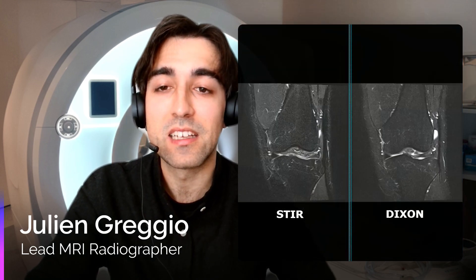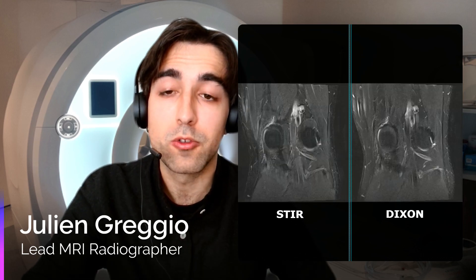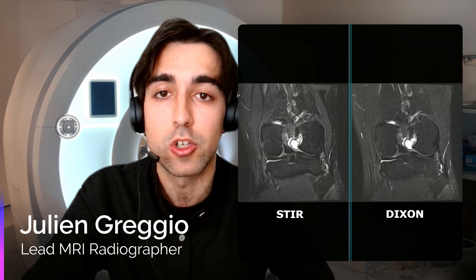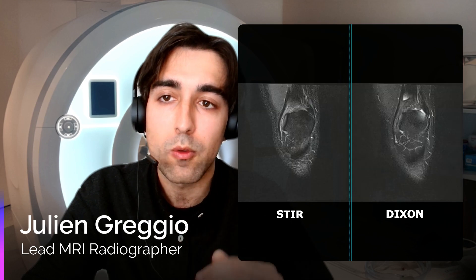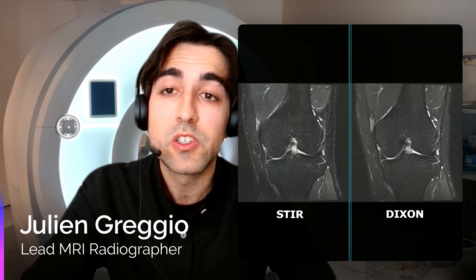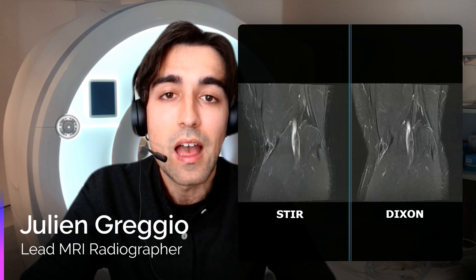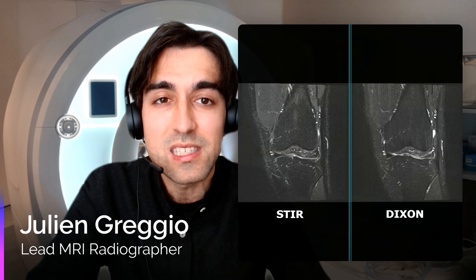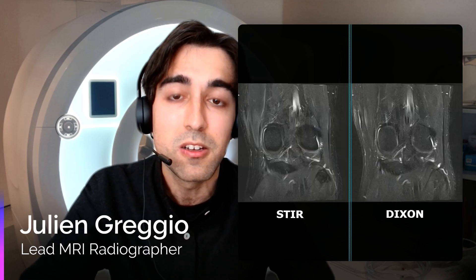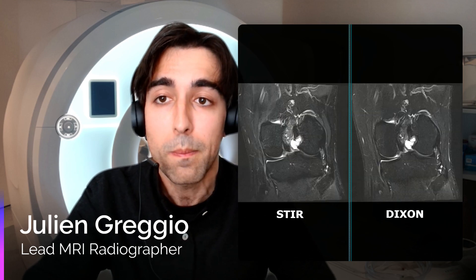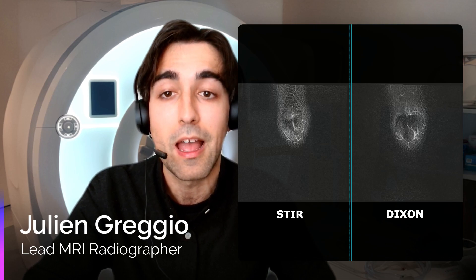Let's see now a quick comparison of the fat techniques evaluated so far. To keep this comparison as fair as possible, the images did not undergo any process of optimization — they have been simply taken from the vendor library and acquired as originally loaded on the scanner. So, STIR and Dixon — which one do you prefer? Both are characterized by uniform and homogeneous fat suppression. STIR images are a little bit more grainy compared to Dixon, but still the contrast differences between different tissues can be very easily picked up. I would say that both are very valuable options when it comes to MSK imaging.